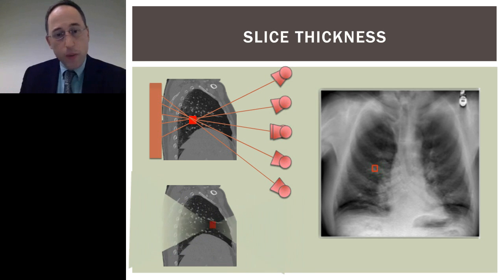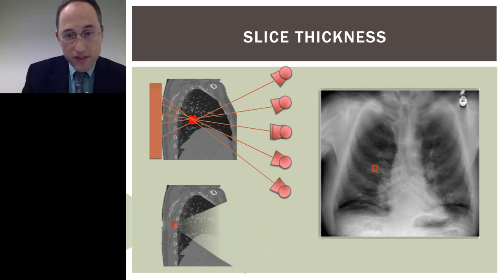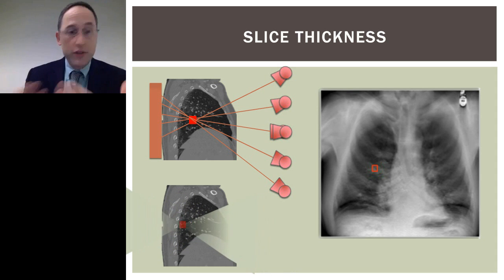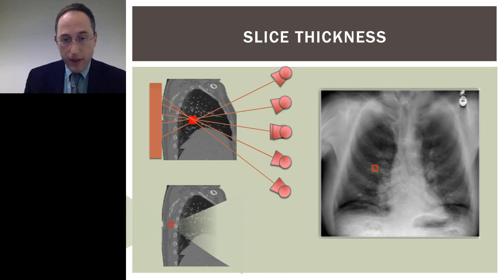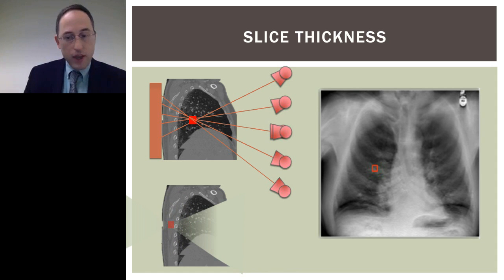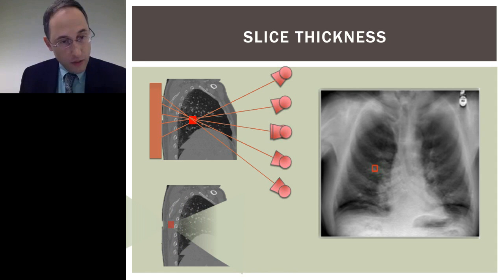That's why when you're toward the back of a patient on tomosynthesis, you see no contribution at all from the anterior chest wall, and also the reverse, as you move through the patient. And there are certain technical factors, say for example, the angle that you decide to sweep, which will make the blurring of anatomy occur more rapidly or slower.